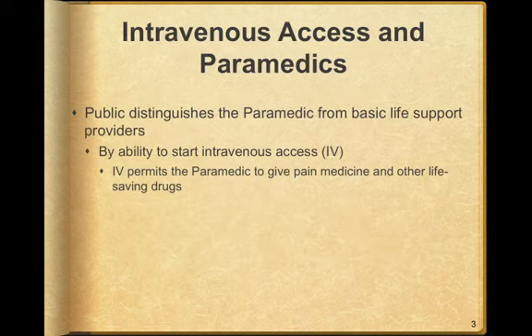Intravenous access and paramedics. The public distinguishes a paramedic from the basic life support providers by the ability to start IV access. An IV permits a paramedic to give pain medication and other life-sustaining drugs.